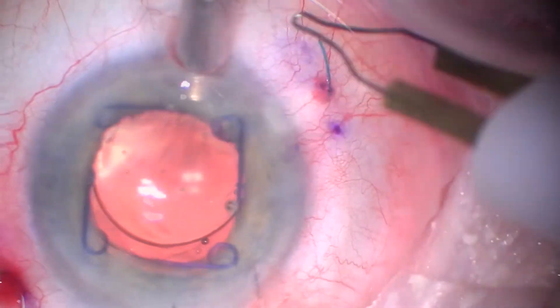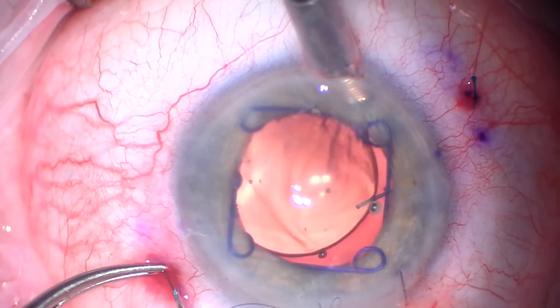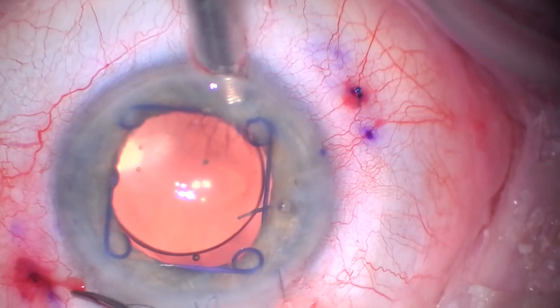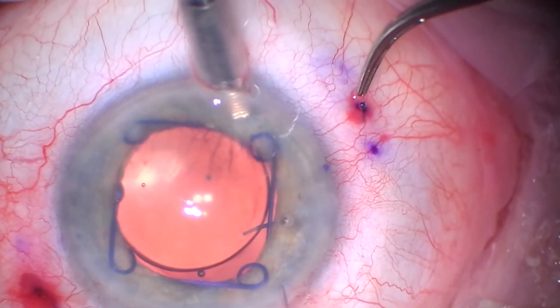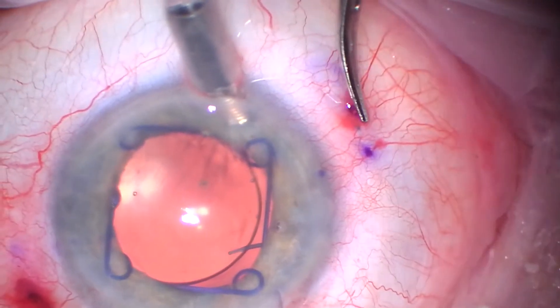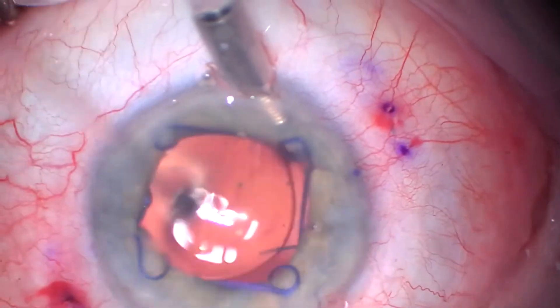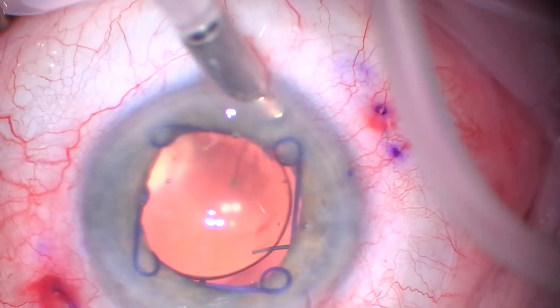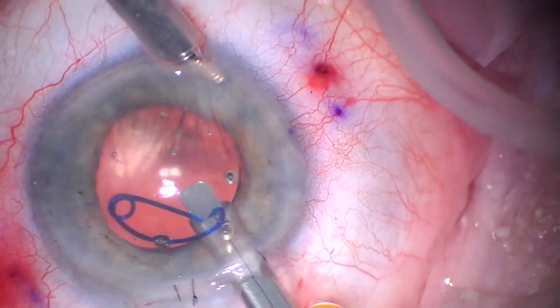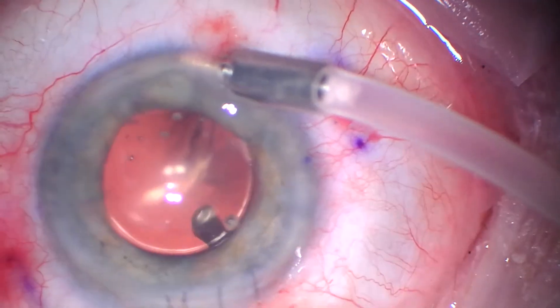Here I'm externalizing and I'm going to cauterize with a low-temp cautery to give a small bulb there. Here what I'm doing is slowly externalizing this one. You can see in the eye, on the right of that lens, there's a little too much torque on that optic-haptic junction, and it's going to make me ultimately be just a hair decentered. There's evidence of a little bit of stress on that optic-haptic junction — the haptic is flared out a little bit — making the IOL sit a little lower on the patient. But I ultimately think that is a very adequately centered lens; I was not about to redo it for that.